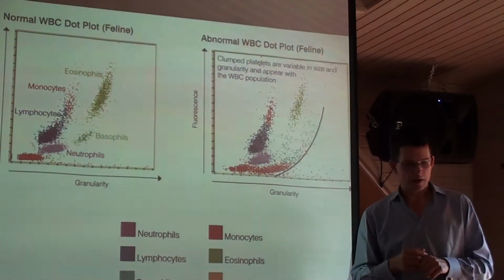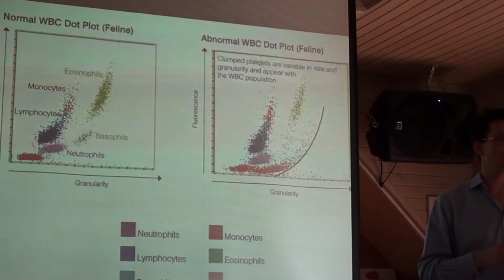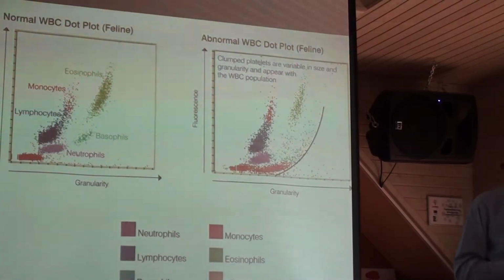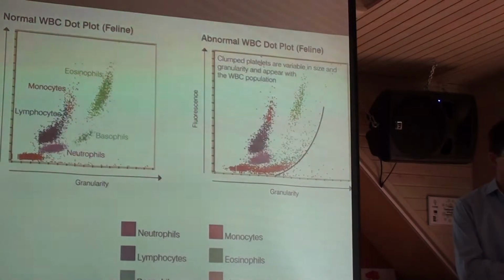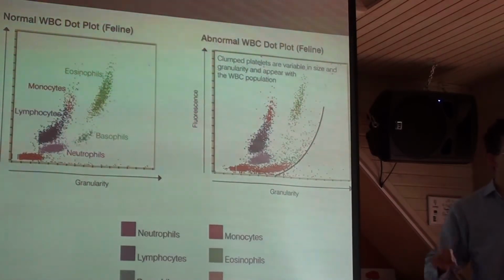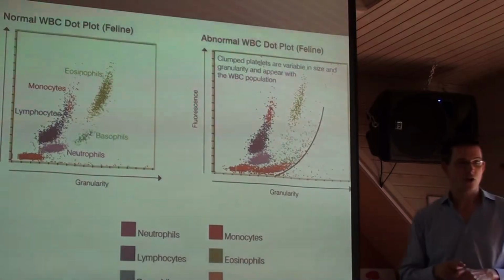What we are hoping that the analyzer does is to put the white blood cells into different areas on the graph. Et sellel graafikul siis masin asetab erinevat tüüpi valged verelibled erinevatesse kohtadesse. So if you imagine you had a collection of fruit and you were trying to sort the fruit into different piles, that is just what the analyzer is trying to do.